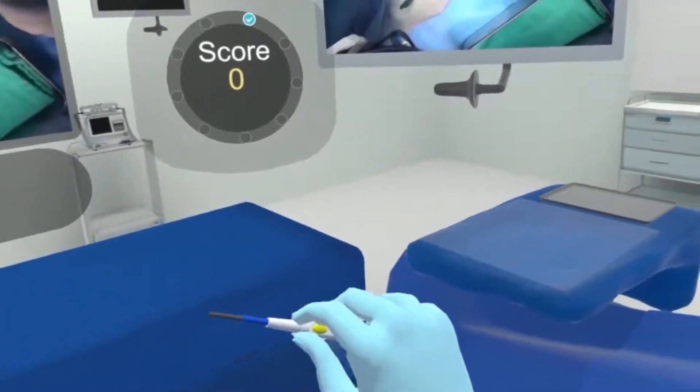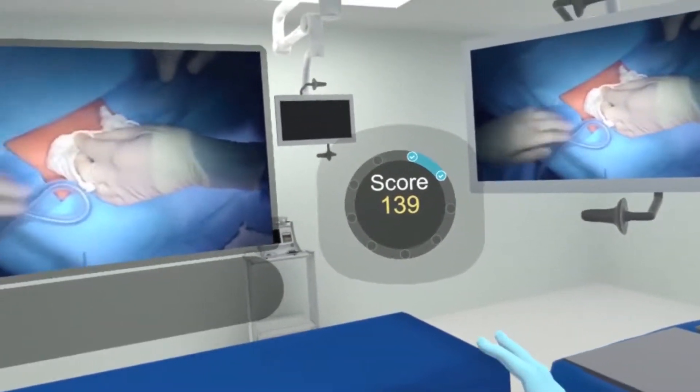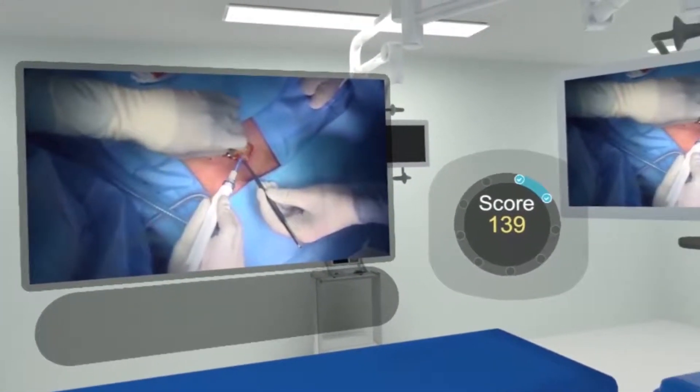We will use cautery to cut through the Camper's fascia. As you can see, I anticipated a little bit there, so I'm getting a higher score on the scoreboard.